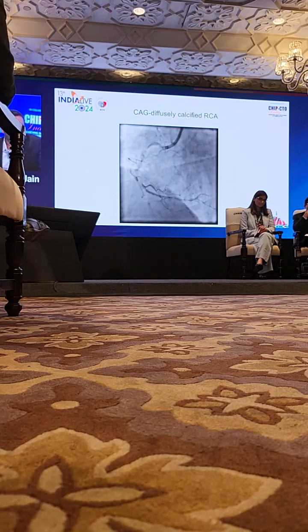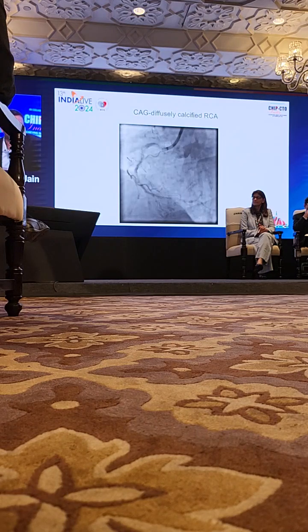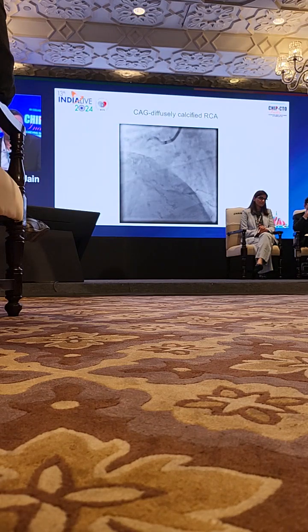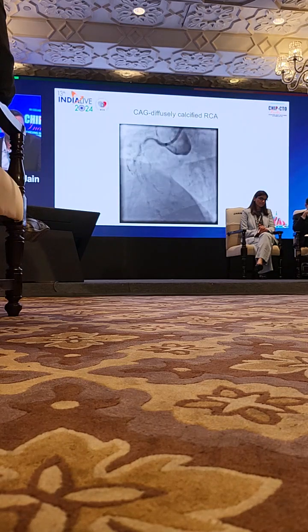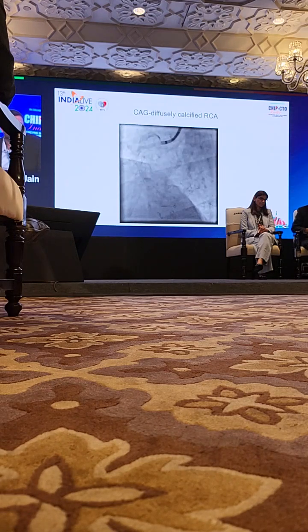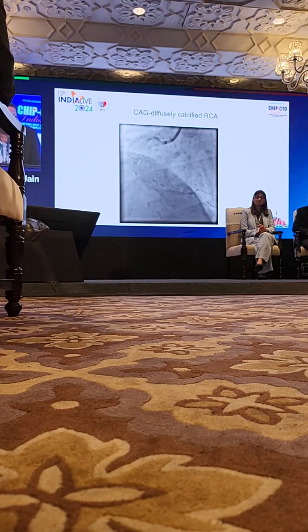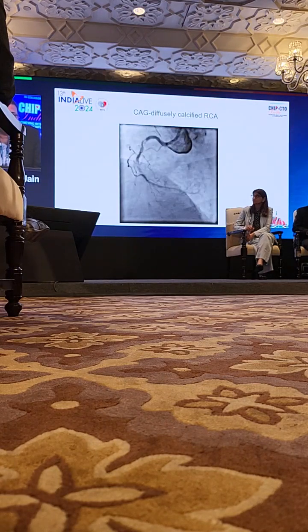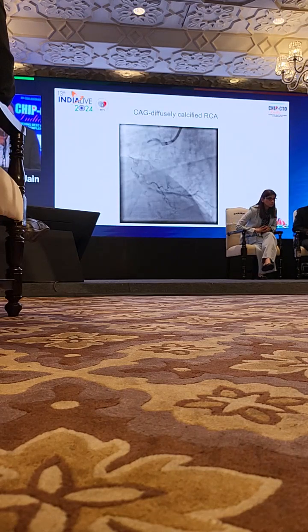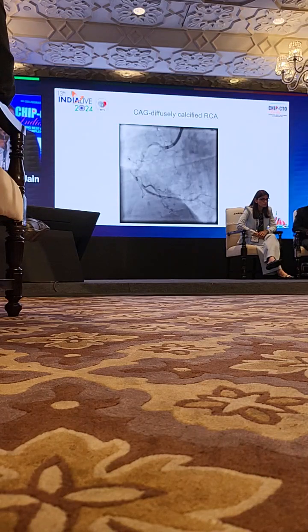As this case was referred from outside, we thought we'd take it electively, with a femoral approach, which gives better support. A 7 French femoral approach was taken, with a good guide, followed by a CTO wire to cross that proximal lesion with microcatheter support. I thought I would go for a rota to modify it, because there was severe calcification down to the mid part.